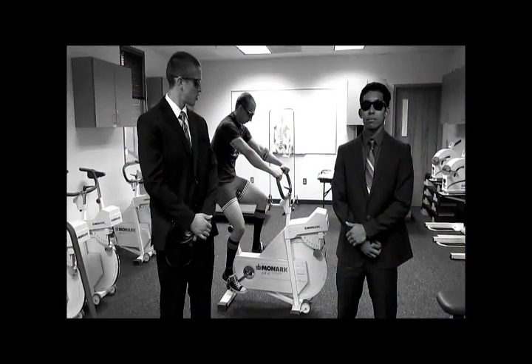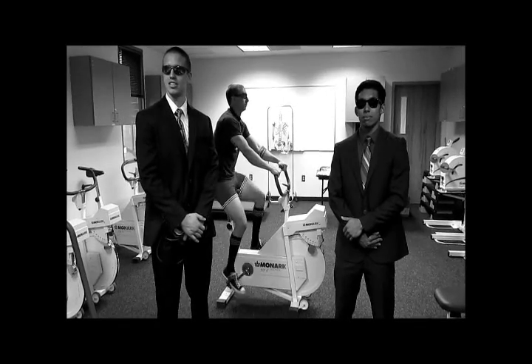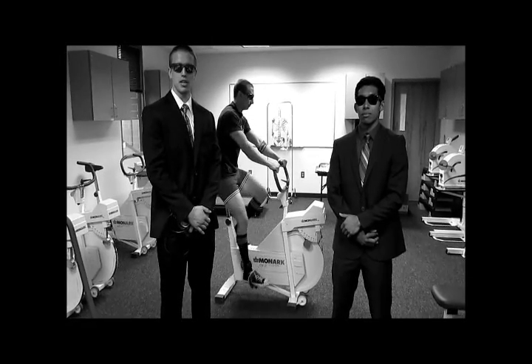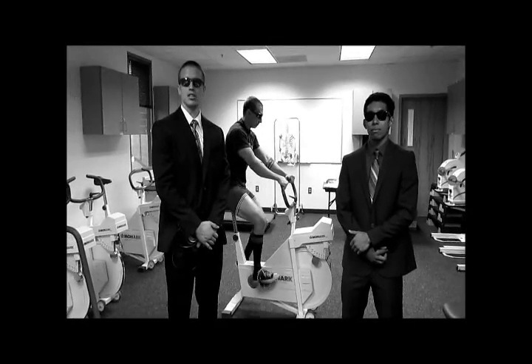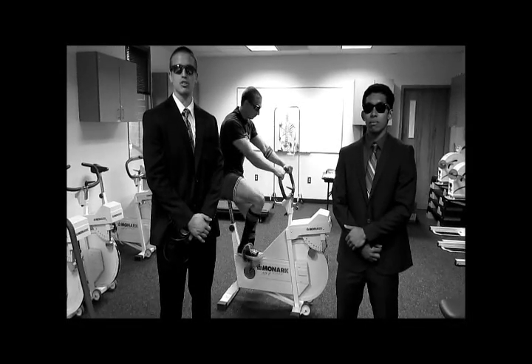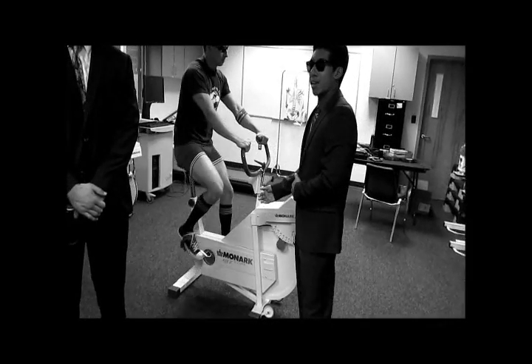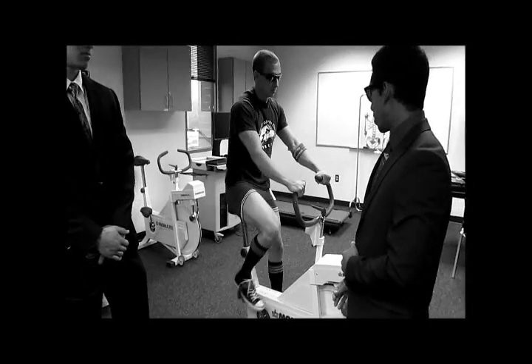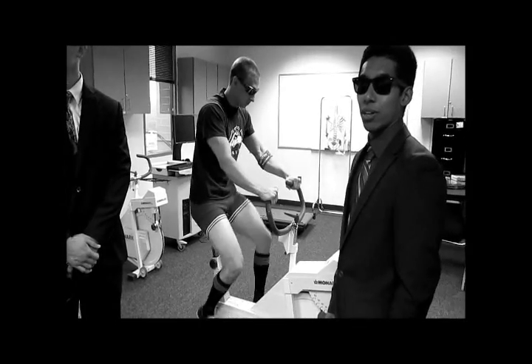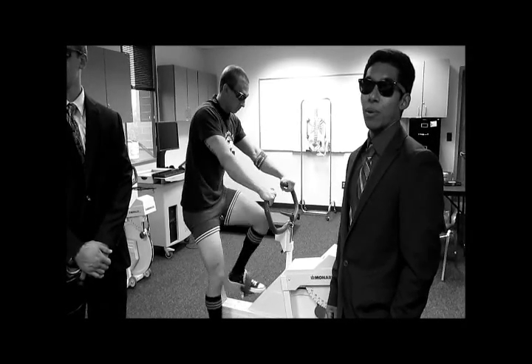To begin the test, participants should start with a light warm-up. The YMCA sub-maximal test is a multi-stage test that uses 2-4 consecutive 3-minute workloads with the goal to achieve a heart rate between 110 beats per minute and 85% of the participant's age-predicted maximal heart rate for at least 2 consecutive stages. Heart rate will be taken every minute during the test, while blood pressure will be taken every 2-3 minutes. We'll start with the initial workload of 150 kgm and a pedal rate of 50 rotations per minute. If heart rate during the last 2 minutes of the stage is not within 5 beats per minute, then add 1 minute to the stage.